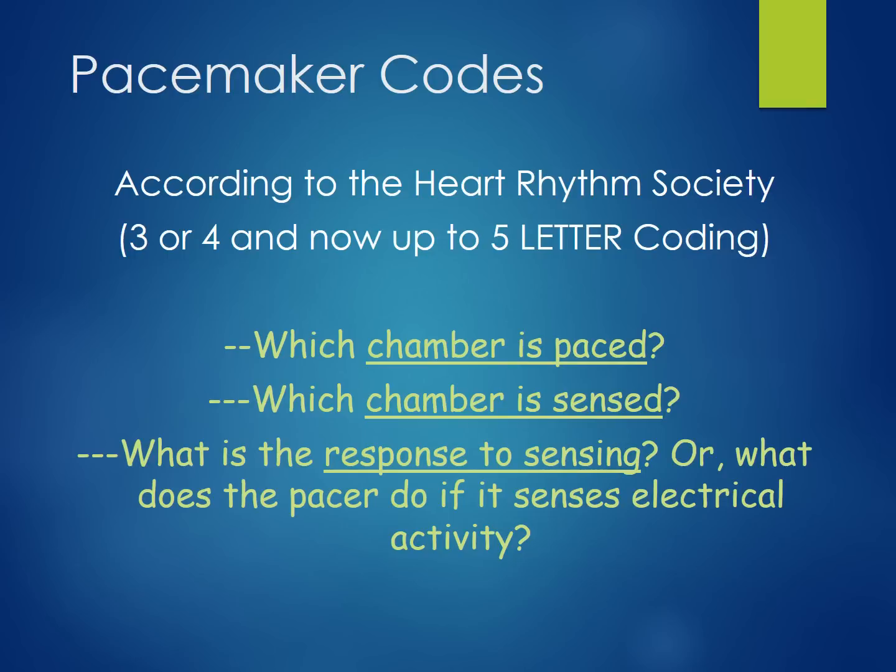So this is a lot of detail that I really don't want you to worry too much about, but just be aware that you may see modes that say VVIRO. And that just is telling the cardiologist and telling the CV-ICU nurse what is going on in each chamber of the heart and what the settings of the pacemaker are. This is not something I will test you on. I just want you to be aware that when you hear these letters being put together, that is just the pacemaker code, telling us a little bit more about what that pacemaker is doing.